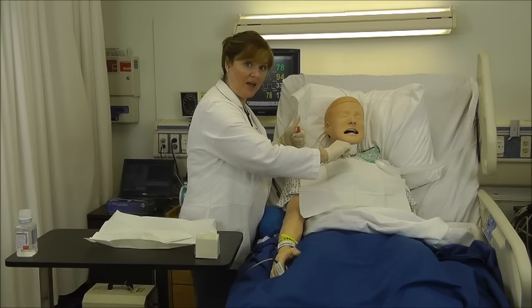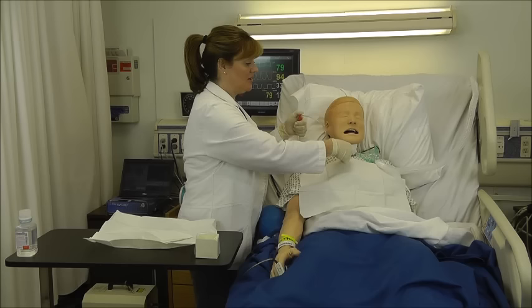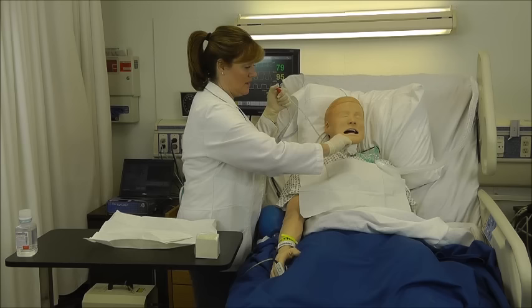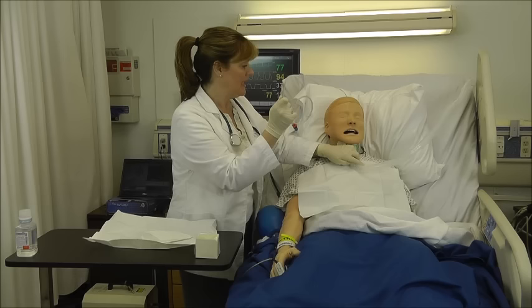Note the marking on the catheter. It's 20 centimeters. From now on, I will only go down to 20 centimeters so I don't keep hitting the carina and causing tissue damage. As I withdraw the catheter, I'll turn it, twisting it left and right, and my thumb goes on and off the suction. That way I won't cause any damage to the tissue. My hand is walking down the catheter so there's not a long piece to come out and hit his chin and become contaminated. I hook this so it doesn't swing around, and I return his humidified oxygen to him.